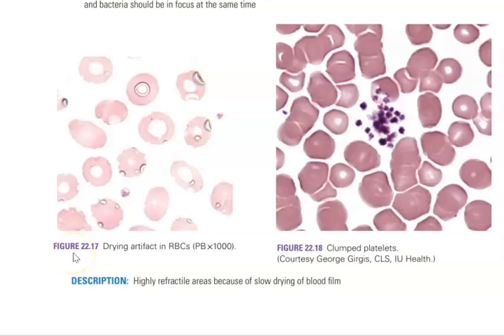Moving down to the bottom of 217, looking at figure 22.17, we're looking at a drying artifact on these red blood cells. These very refractile looking bubbles on top of our red blood cells are a result of drying. And again, it's highly refractile, meaning that it is shiny when you focus up and down on the blood cells.